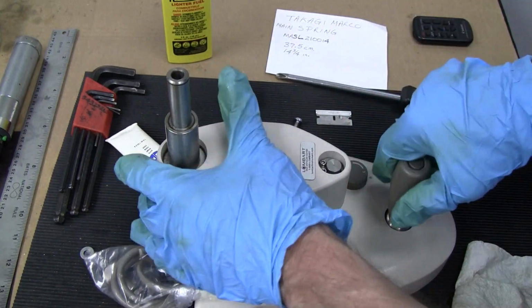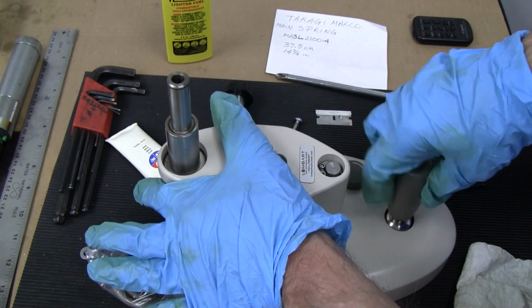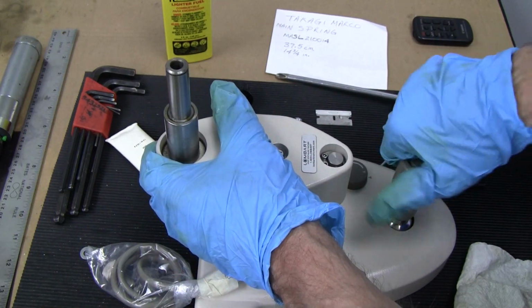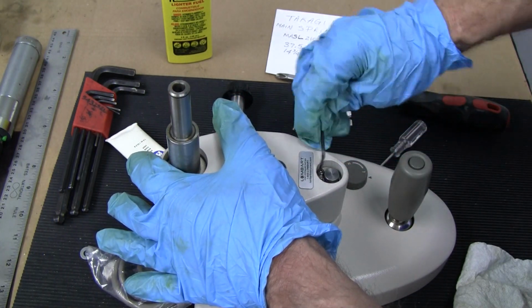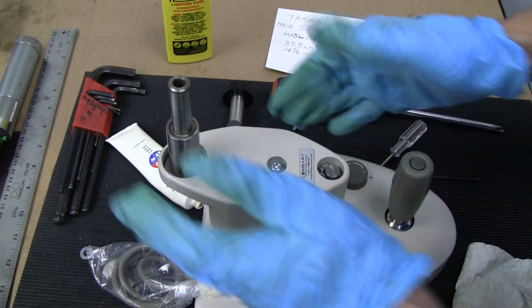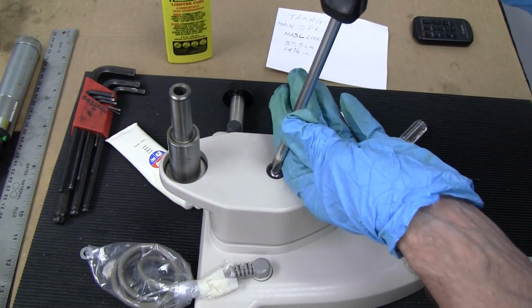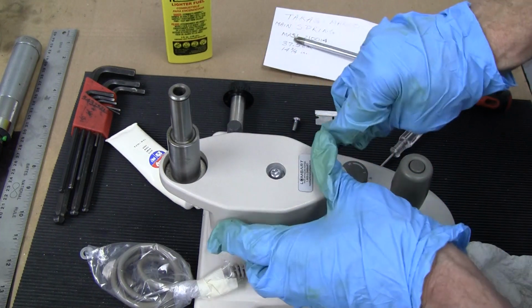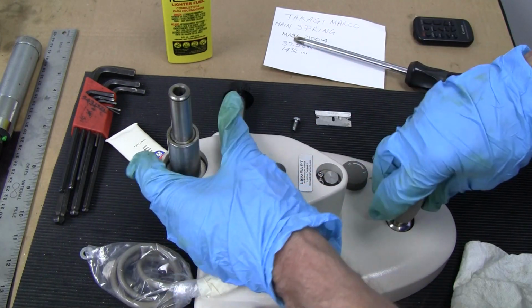Okay, once you have those in, operate your joystick mechanism up and down. Make sure it's traveling okay. You might want to loosen everything just a little bit to let that bearing assembly seat like it should. If you like it, go ahead and tighten everything. Check it again.